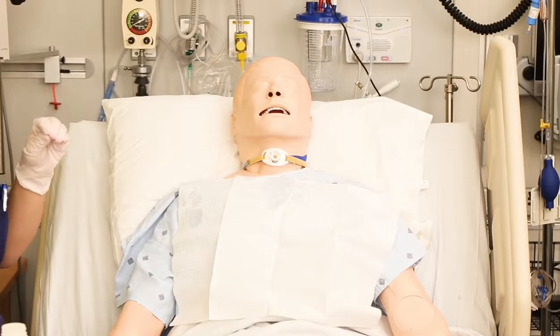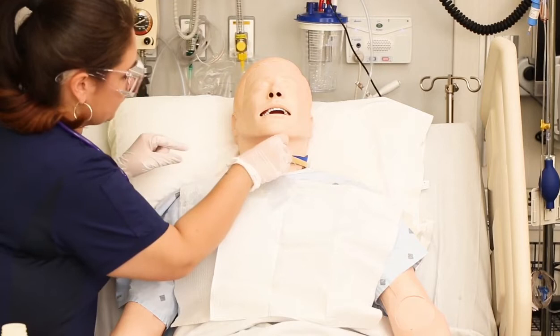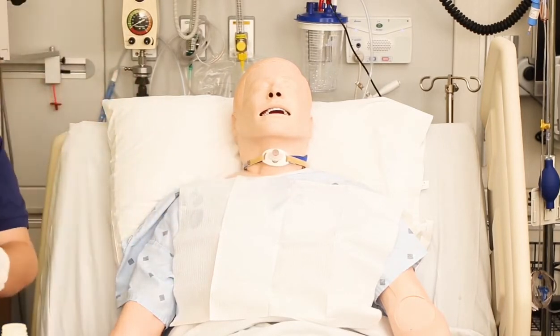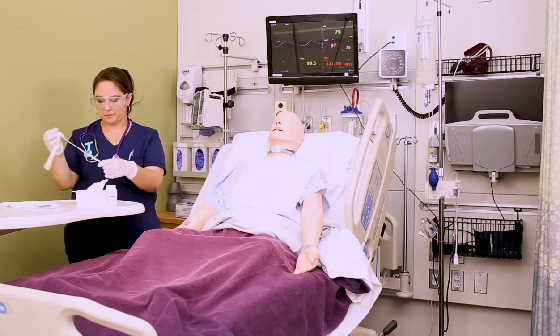Now, once you're satisfied with the cleaning, it's time to replace the inner cannula. You want to put it in at an angle first and then follow the curvature of the cannula in order to put it into the trach, and then make sure that you lock it in place.